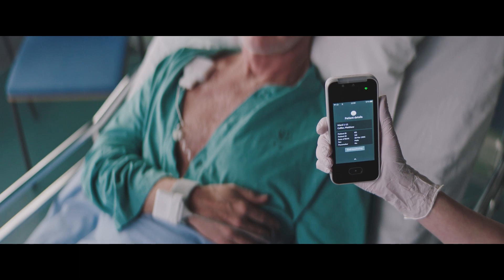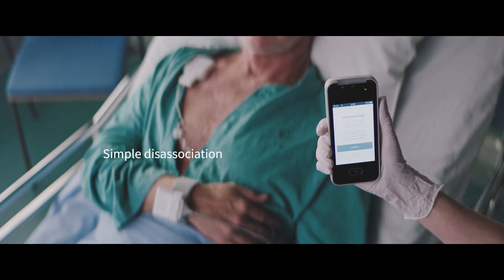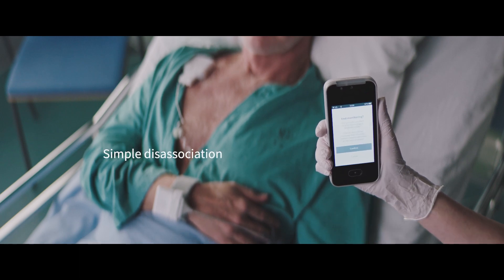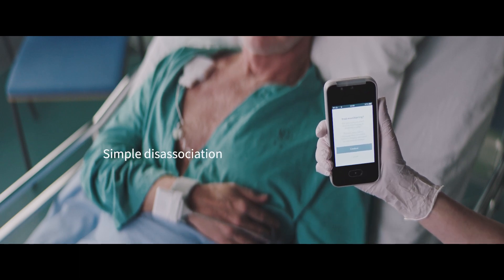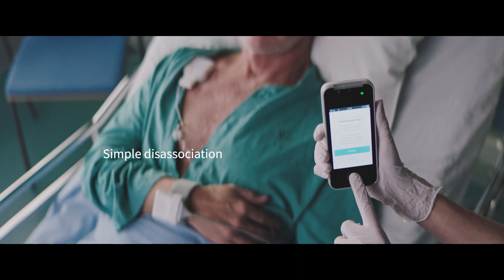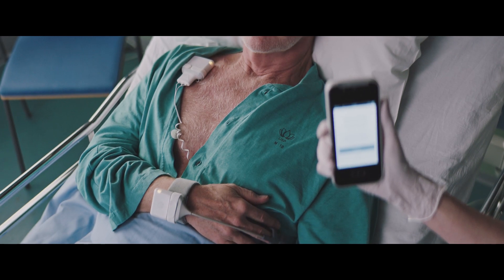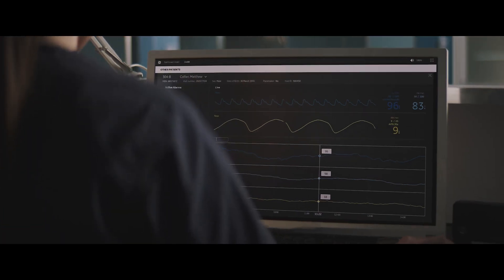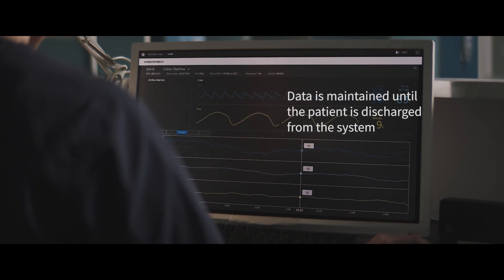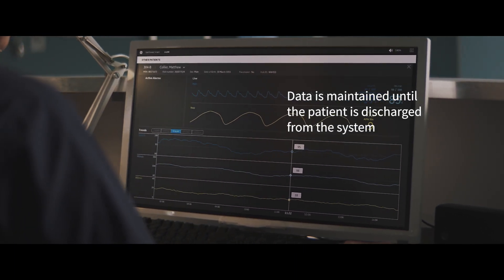When the patient no longer requires continuous monitoring, the nurse may end monitoring at the patient monitor. Once a session is ended at the patient monitor, all data is still available at the Portrait Central Viewer until the patient is discharged from the system.